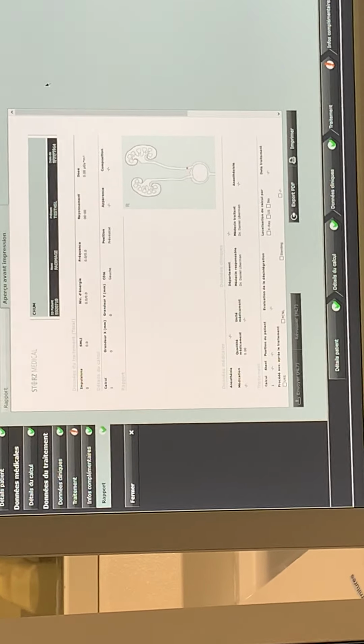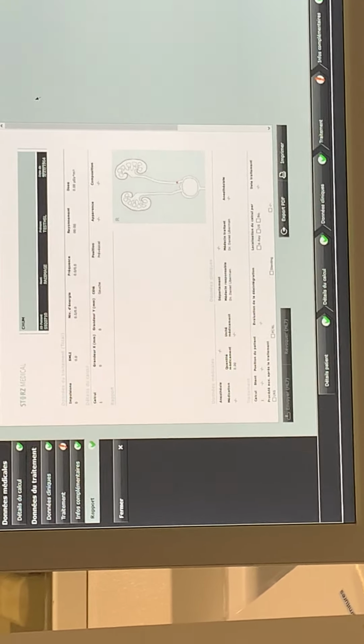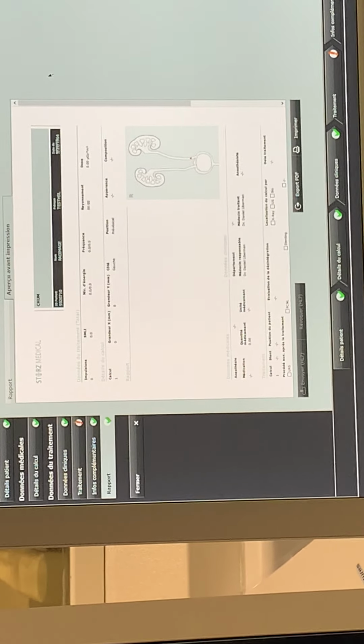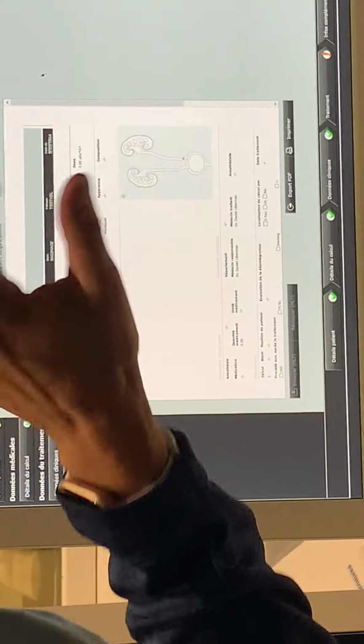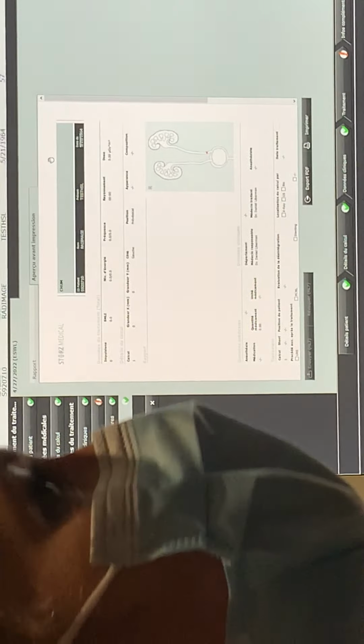Could we have a standard template that we could use? This is the standard template. Okay, but is there room to put the... no, this is the no-code, the black code? No, that's not possible. You mean the stickers? Yeah, the sticker. But look here, the sticker. We can write things in there? Yes, you can write things in there. So we could put a template in there for everybody, every one of us.